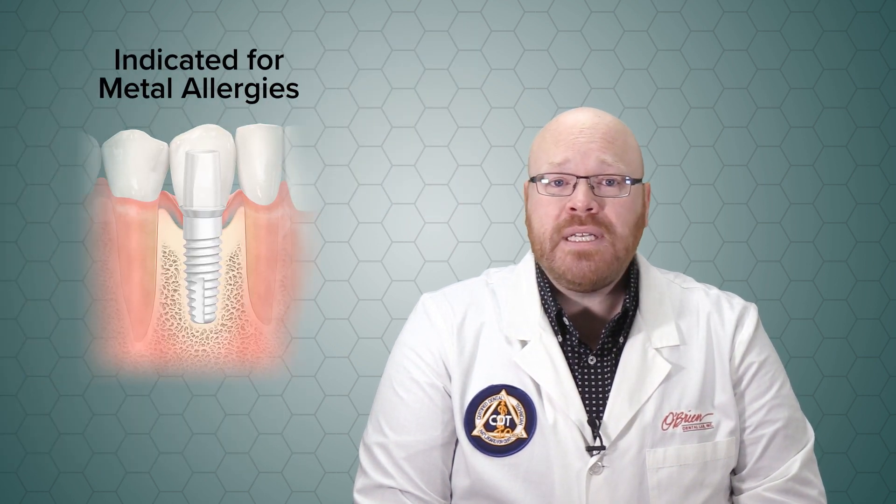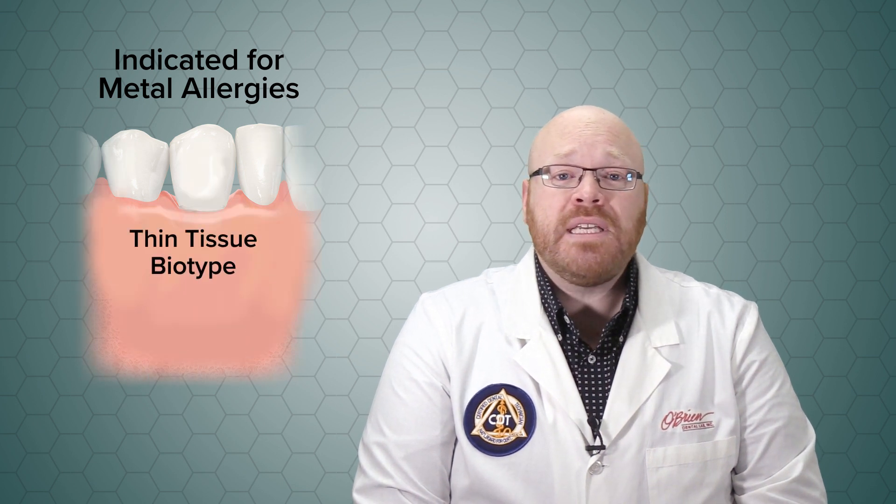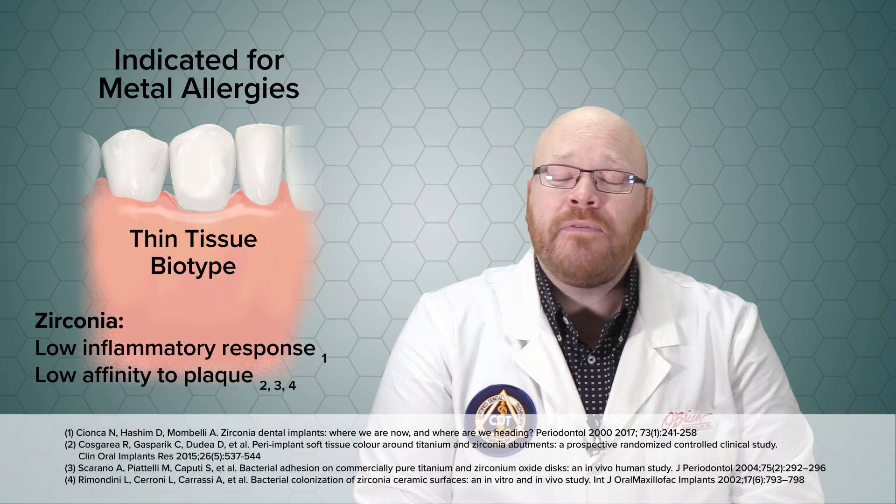This system is particularly indicated for patients with metal allergies, but zirconia is also aesthetically beneficial for patients with a thin tissue biotype. Additionally, zirconia has been shown to have a low inflammatory response and a low affinity to plaque.